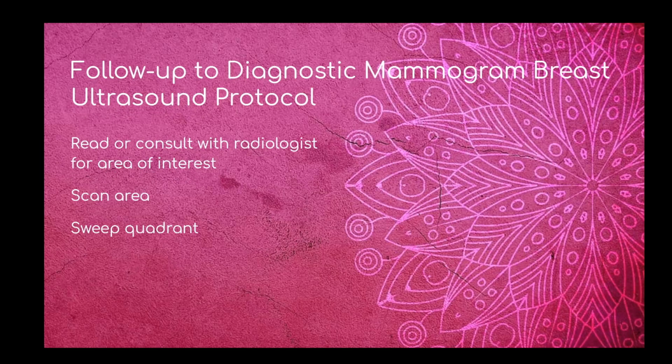Following up to a diagnostic mammogram then is another very common reason that we will be doing ultrasounds. So again, make sure to consult with the radiologist to identify the area of interest that we want to scan. Scan just that area, again, for the same reason. We don't want to go out too far. If we start finding more things, then we have to document, possibly biopsy more areas or FNA more areas, and it just kind of creates a mess, more confusion for everybody, more work for everybody. So scan the area that is indicated and maybe a couple clock faces in either direction.